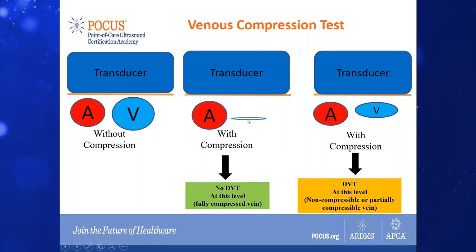You can do counter-tracking, and also when you're doing the scan of the popliteal region, you want to put counter-pressure on the kneecap just to make sure that you're not causing the patient too much discomfort.